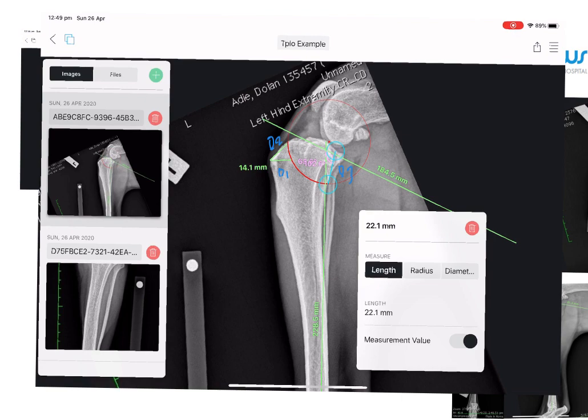It's really important to make sure we have a wide enough tibial crest at this location. In most dogs we want to get at least a centimeter — 10 millimeters — of bone, especially in dogs greater than about 15 to 20 kilograms, to make sure we have a reduced risk of a tibial crest fracture. That's how we measure the D1, D2, and D3 landmarks.